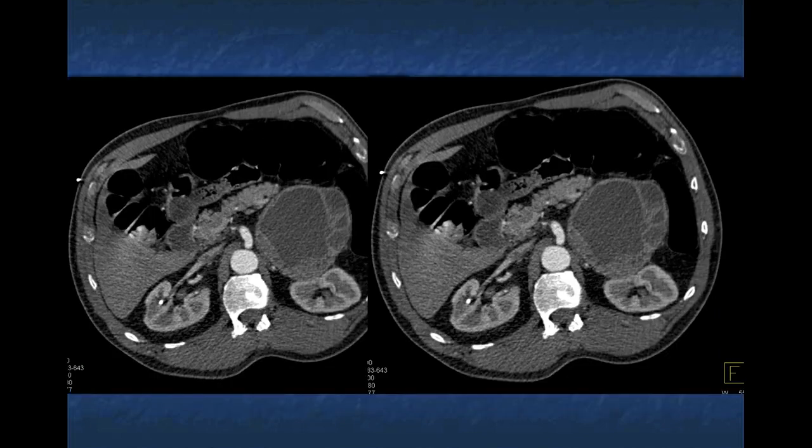Now, I've showed you a number of adrenal lesions over the past few weeks. I gave you a talk, and one is coming up, a 4-parter on large adrenal lesions. Well, you think of cystic lesions, well, maybe it's a primary adrenal cortical carcinoma. That's a good thought. Maybe it's a met. Patient had no history of primary. What else? Hemorrhage, that would be a thought. Hemorrhage can give you all sorts of funny appearances, but the patient was not on anticoagulant therapy, had no history of trauma. Of course, you can have things like adenomas that bleed. That would be a thought.